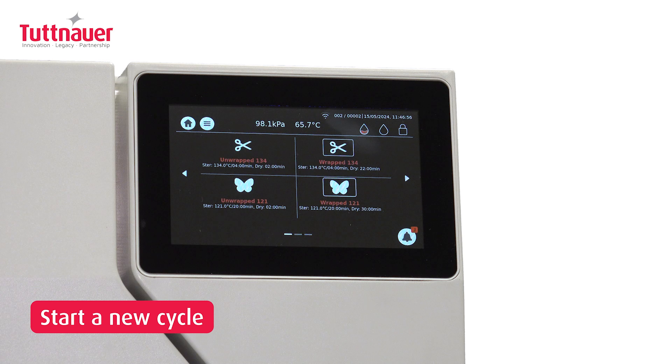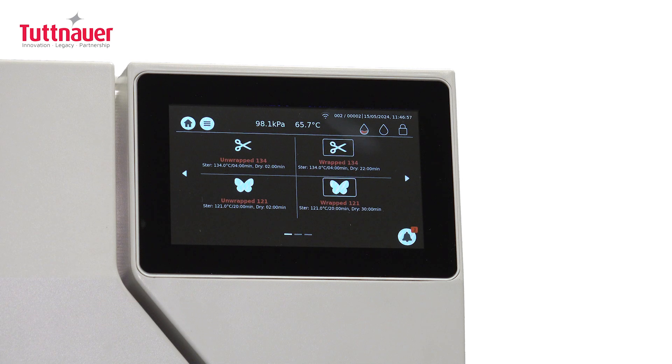With these easy steps, your T-Top System is now clean, fresh, and ready to perform at its best. Remember, regular cleaning with the T-System Clean Tablet is key to maintaining your system's efficiency and longevity.